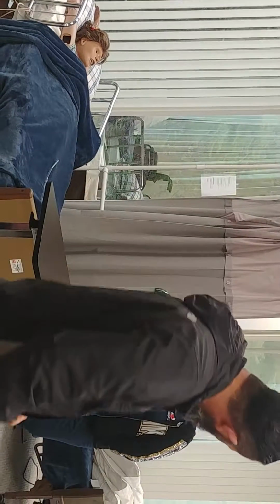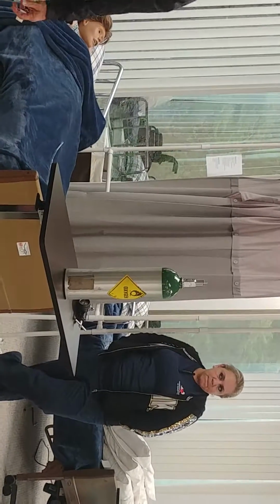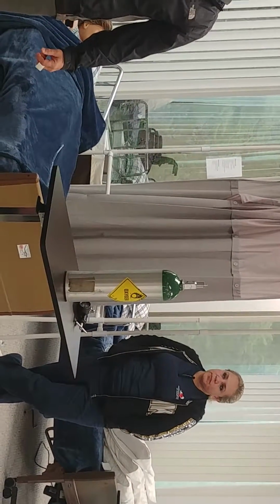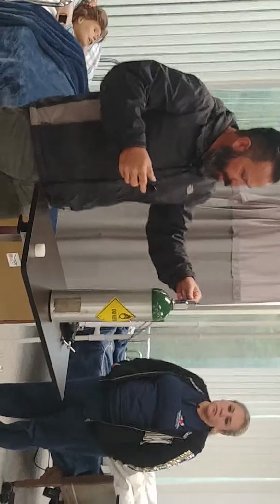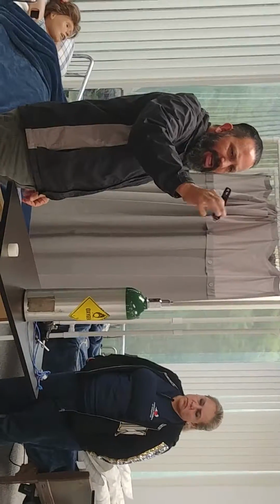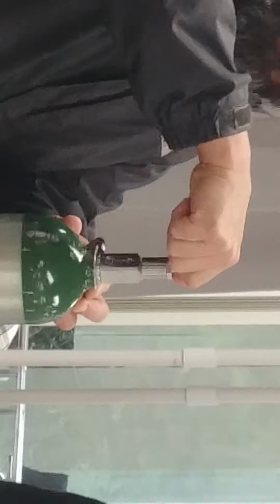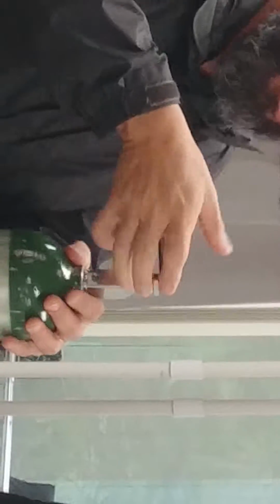So this is what the bottle is going to look like. Give me one second. Did you happen to see the wrench, the little cylinder wrench, that we're going to use? We need a device like this because it fits here, and it gives us the ability to open and close the bottle. It's very difficult to hand tighten, so we're going to make sure we have this wrench available with us.